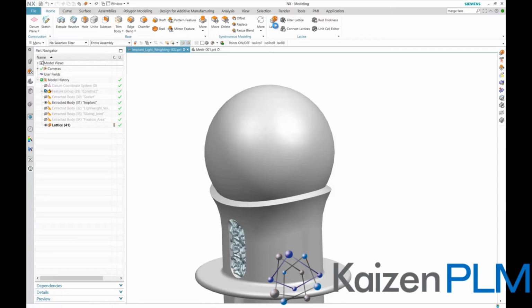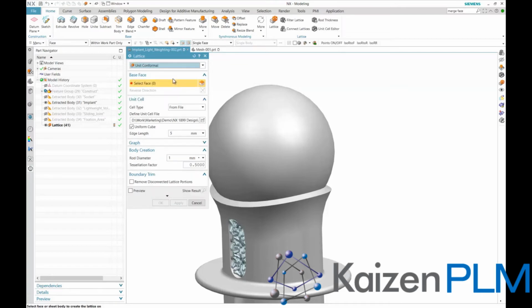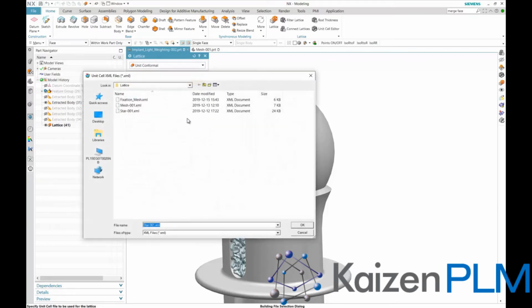With the surface we intend to use as base for our lattice exposed, we again evoke the lattice function. We change the lattice type to unit conformal, which will create a lattice pattern where all the angles strive to be equal. This will create a perfect lattice for our purposes. We navigate to and select our just custom-made cell type.